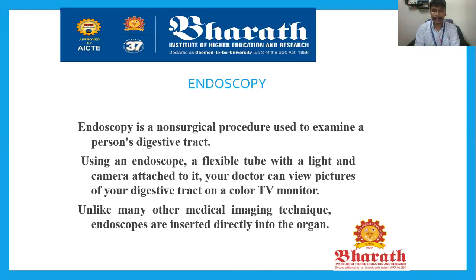Unlike many other medical imaging techniques, endoscopes are inserted directly into the organ. In medical imaging techniques like CT, MRI and PET scans, people extract the image without inserting anything. But in endoscopy, doctors directly insert the light-mounted camera on a flexible tube into the human body, and the internal physiology is directly captured through that camera. This is known as endoscopy.